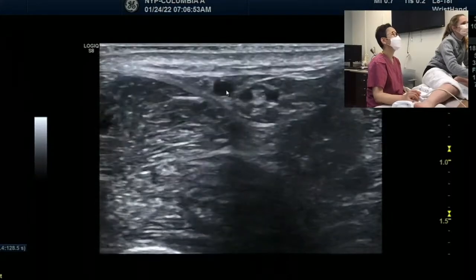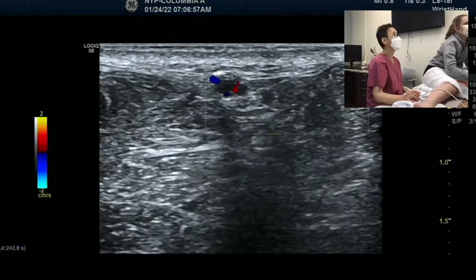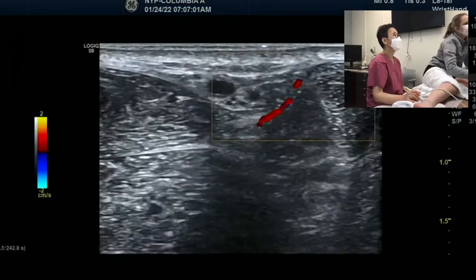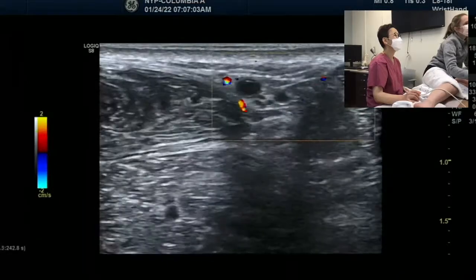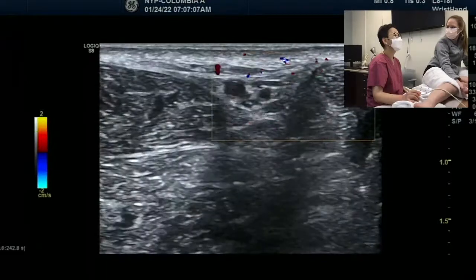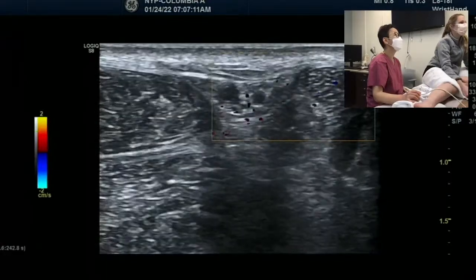So it's like your fibrillar pattern, yeah. And then we have our small saphenous vein. Can you put the color flow? So yeah, there it is. But why doesn't it fire? I don't know if it's because I'm so bradycardic at baseline. Why is the blood not showing? Oh, there it is, finally.